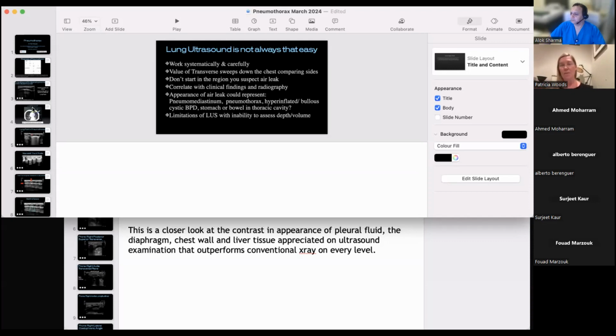So let's say you have intervened and you have put in a chest drain or a needle. The physics is almost instantaneous. If you've actually drained that air at that point, you will have the parietal and visceral pleura come back together again, and you can see resolution. It's limited if you have a chest drain in situ and a dressing, like Tegaderm and all that lot. You can't really use ultrasound in the dressing area, so that might limit your views. But you will certainly see that air leak resolving when you've got parietal and visceral pleural contact again.